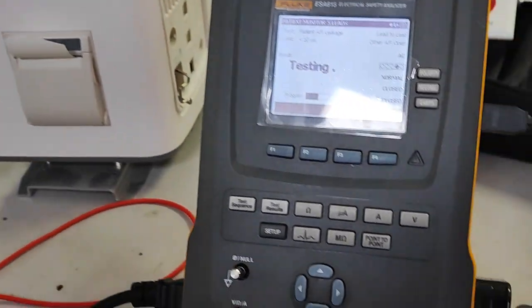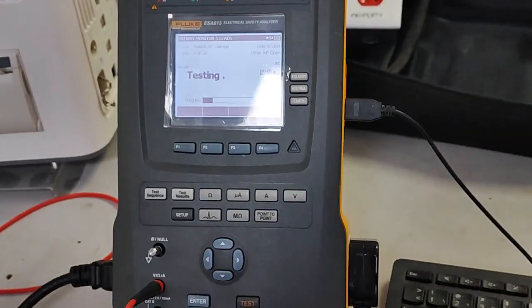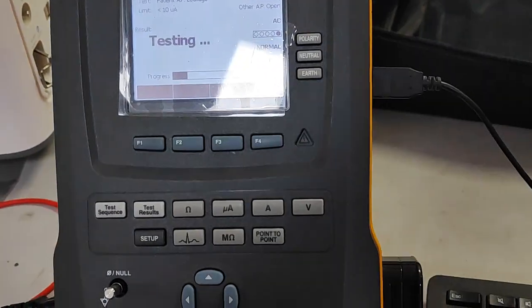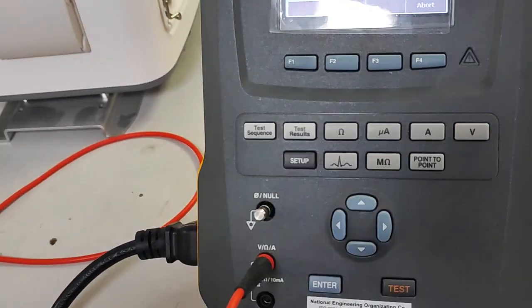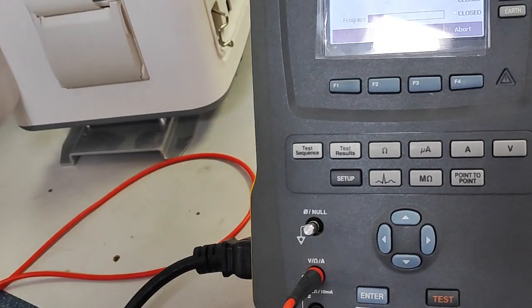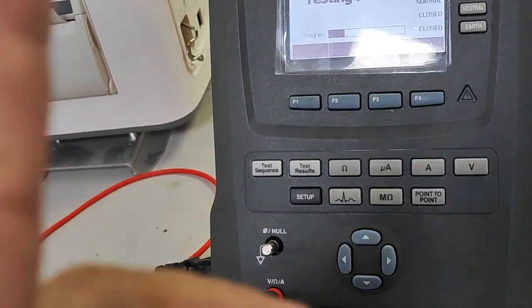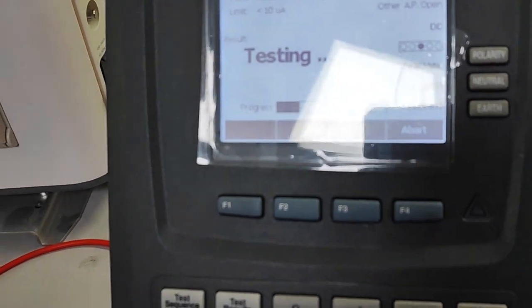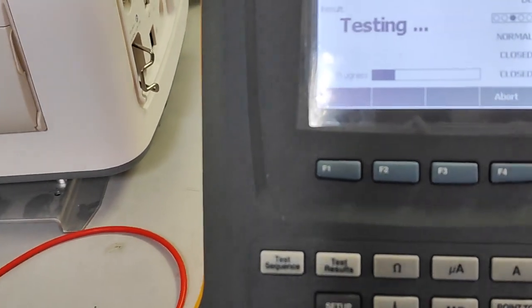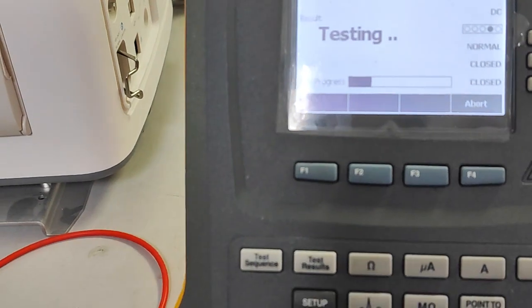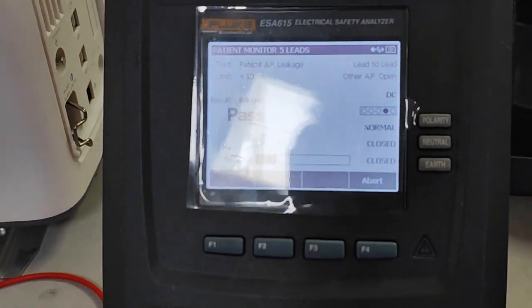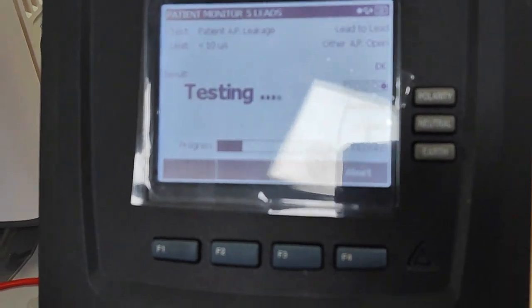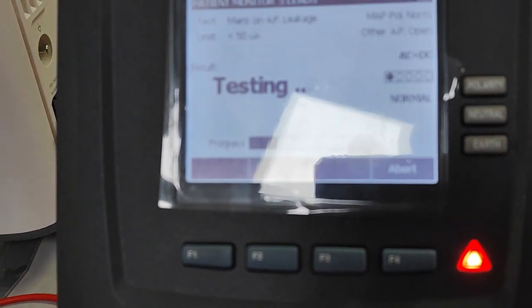It's that easy to use this Electrical Safety Analyzer. If you are testing equipment that has no grounding, you should use Class 2. We are now using Class 1. Just wait a minute — we just finished. All is passed, all is passed.